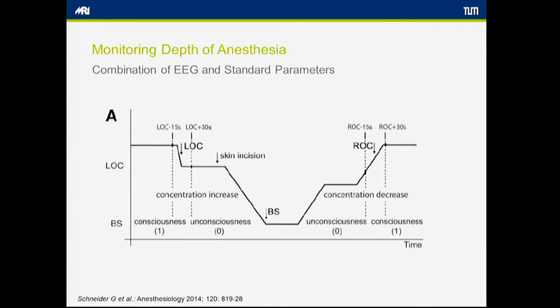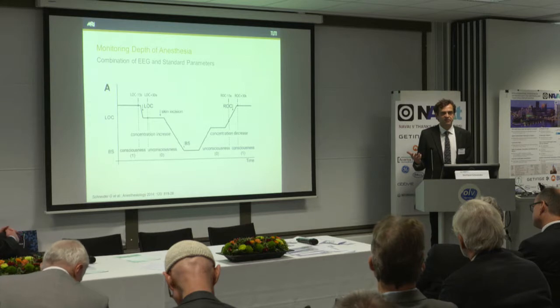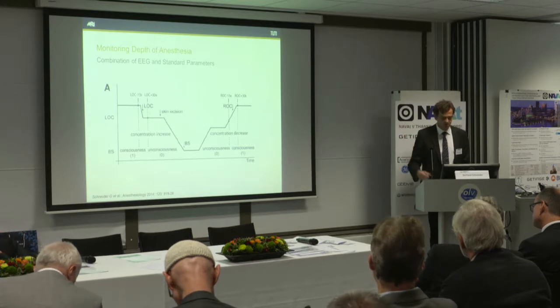After that, we decreased the level of anesthetics to a clinical level of anesthesia, and at the end of surgery, we performed this assessment for return of consciousness, being the ability of the patient to respond to command.